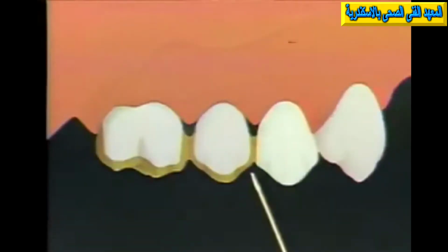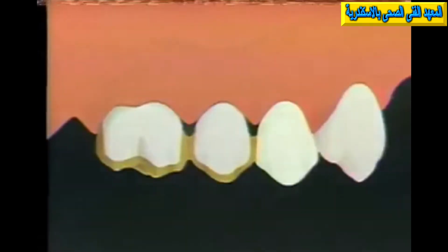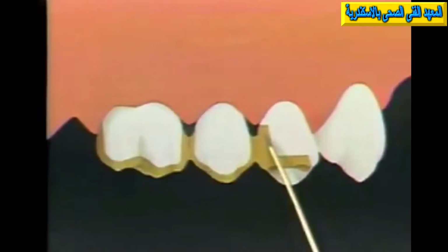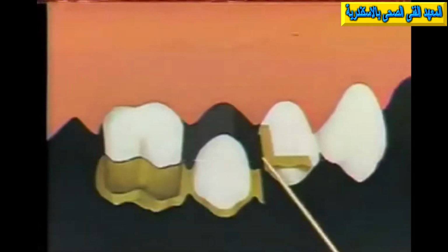By interposing a semi-rigid connector here, which would break the stress between the main part of the bridge and the pontic and this mesial retainer, it's possible to use a two-surface gold inlay on the bicuspid here and so expose the minimum amount of gold and also cut the minimum amount of tooth during the retainer preparation. Now, if we remove the labial surface of this tooth, you can see in cross-section now a typical Class II inlay with its occlusal key and the distal proximal box down here, and the semi-rigid connector has been cut into this area here. Now, if we move down the posterior part of the bridge, you can see the relationship between the key and the keyway.